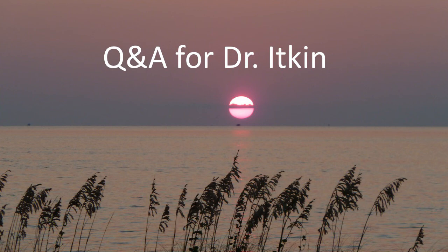The question is, what if I'm allergic to contrast dye? The contrast we inject is gadolinium-based contrast. There's almost no allergy to that. However, if somebody has an allergy, we can do a special prep to combat this condition.